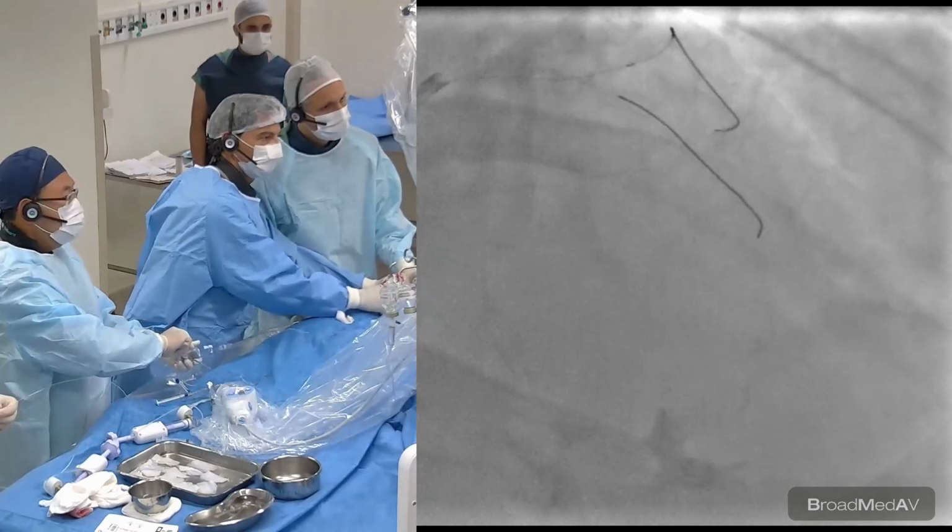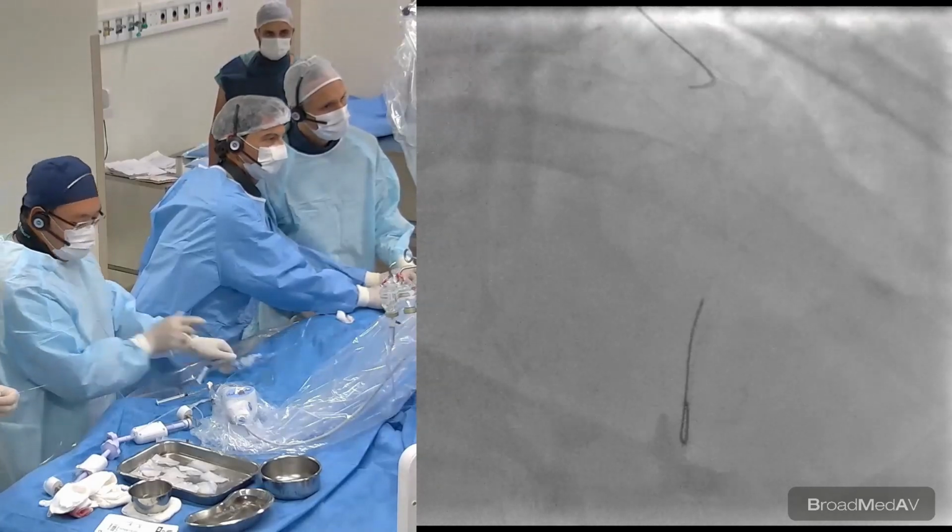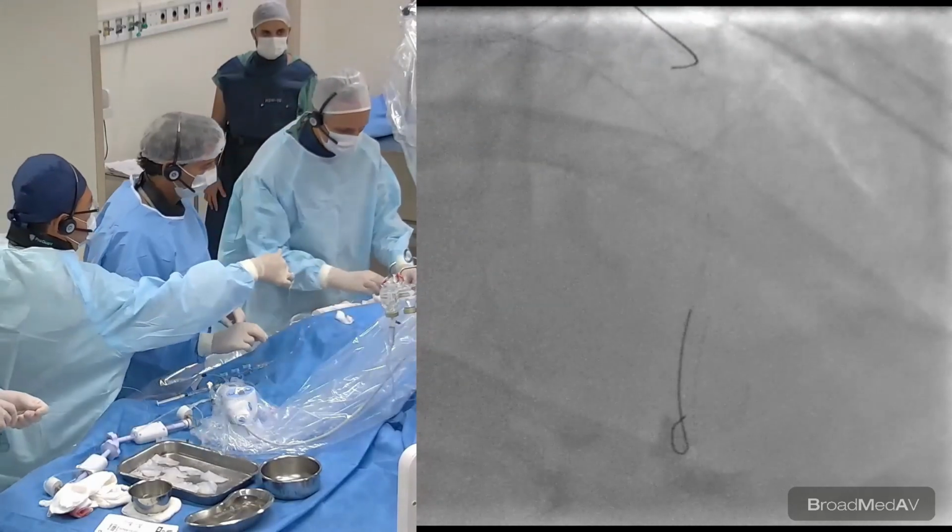I think it's a little bit... Yeah. Okay, great. Okay, good position.